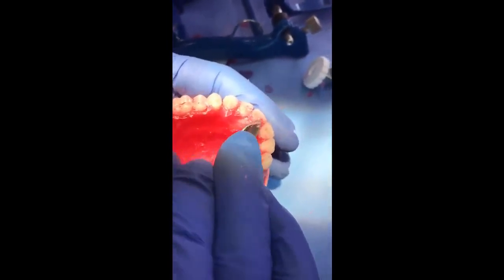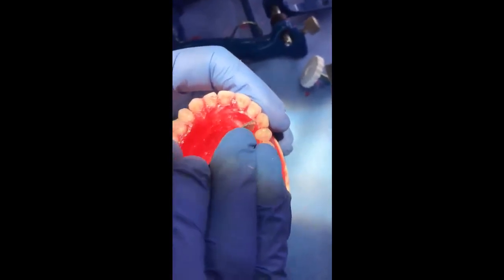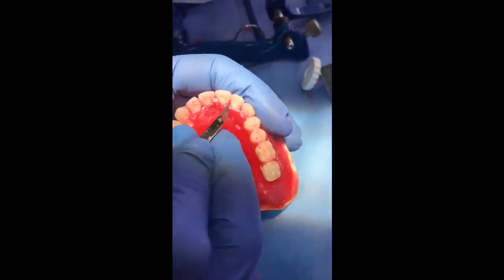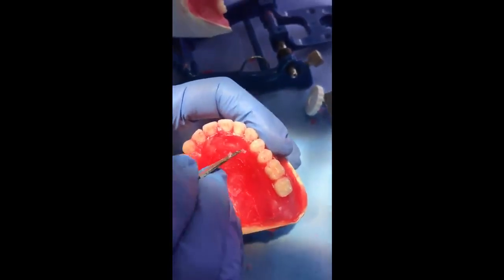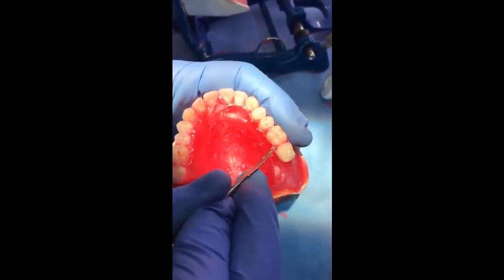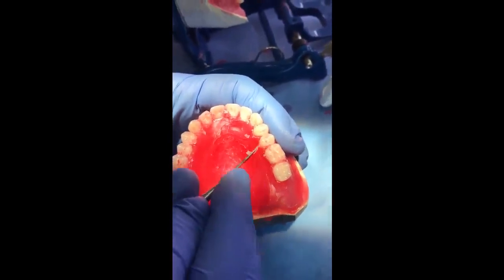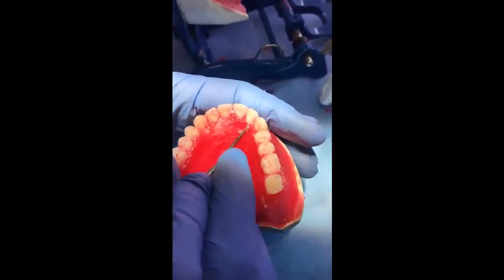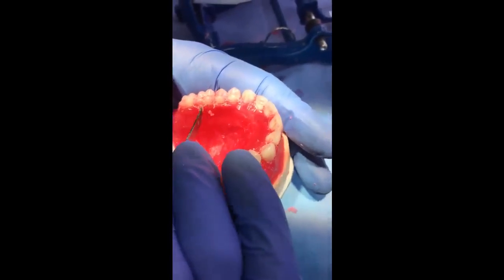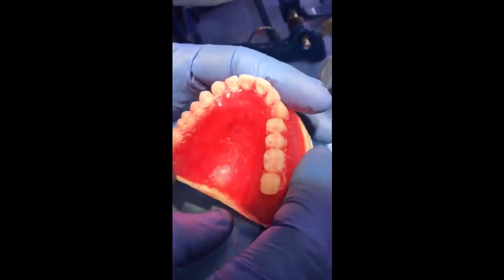Now this is the ledge around the teeth. You can use the Le Cron carver as it has a sharp tip, so you can control the movement of the instrument in a better way. Now after we created the ledge, we bevel it a little bit and we clean the wax from the palatal surface. The palate will be ready by this.